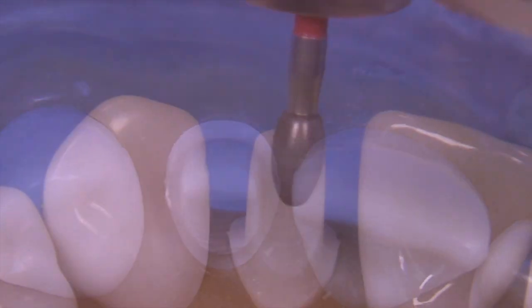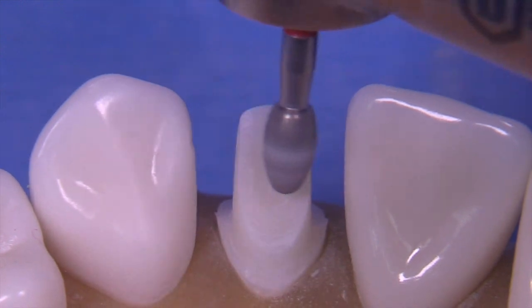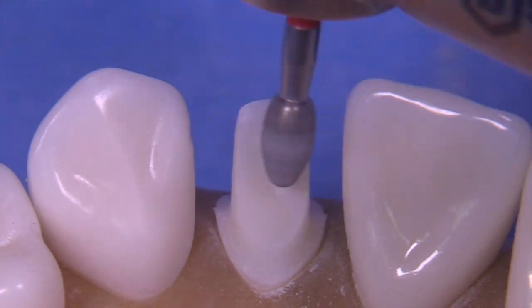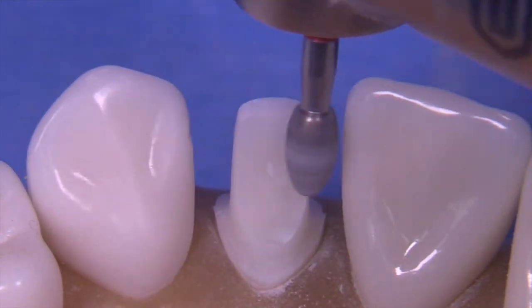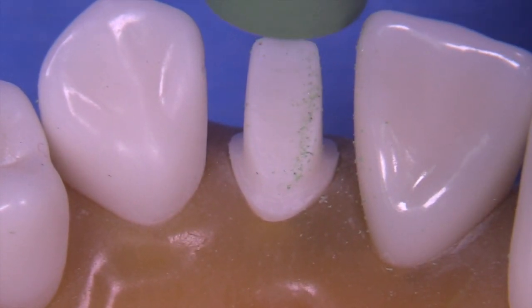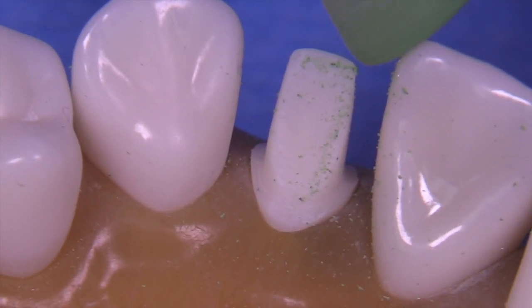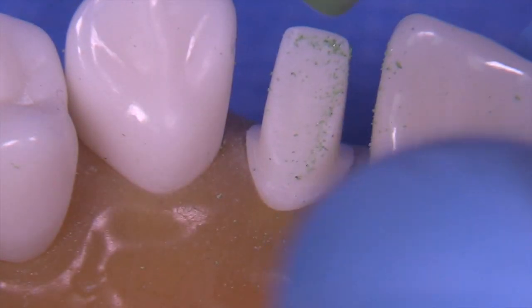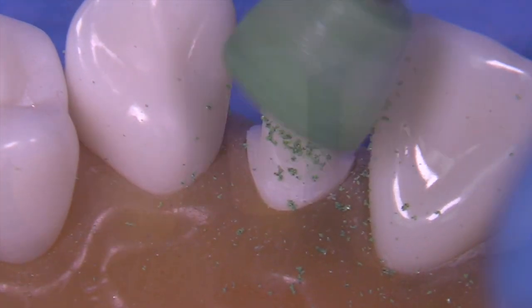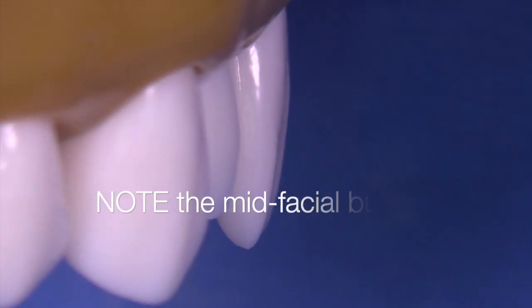I think it's coming along pretty well. Now we can utilize the fine diamond egg-shape or football-shaped bur to smooth off the lingual and get just a little bit more reduction — probably another tenth of a millimeter or so. Then some kind of a composite polishing cup or disc would be really helpful. I use these in clinical practice all the time while preparing natural teeth; it creates a beautifully smooth finish.